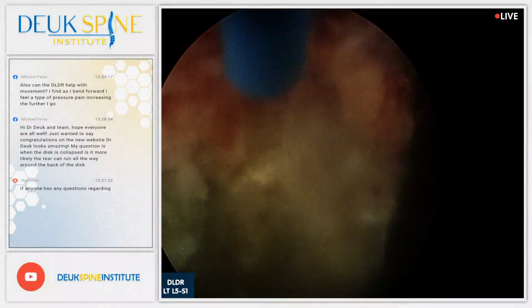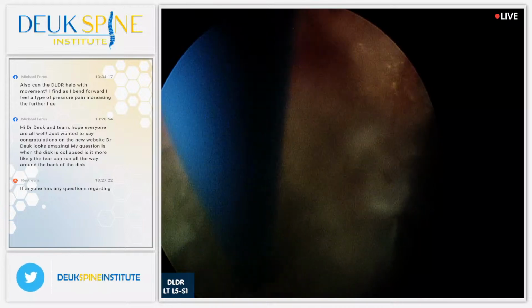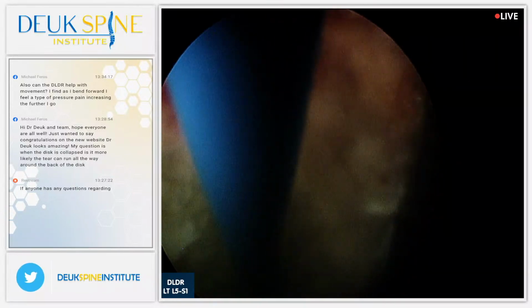Let's get the grabber one more time. I probably shaved down about 50% of the herniation at this point.